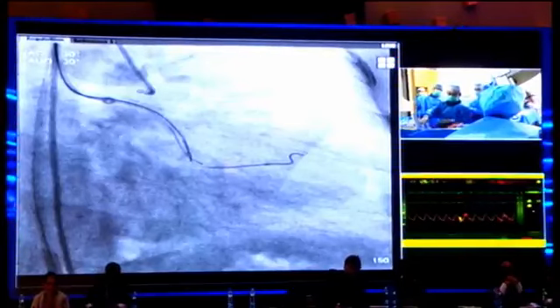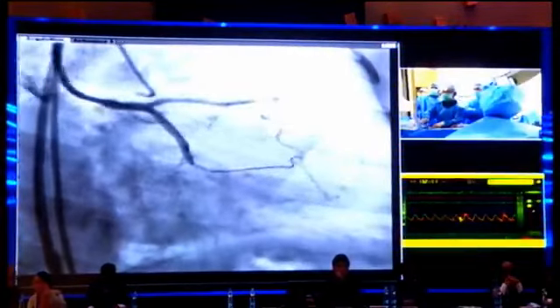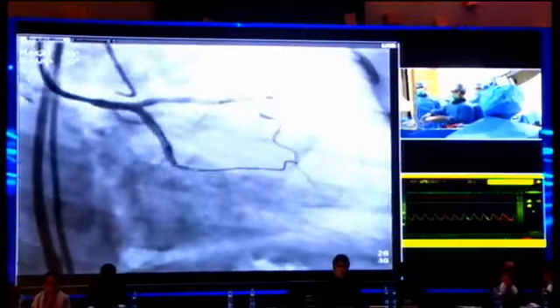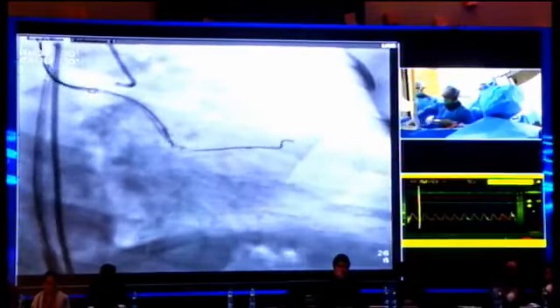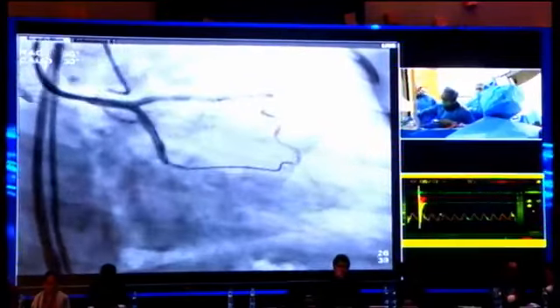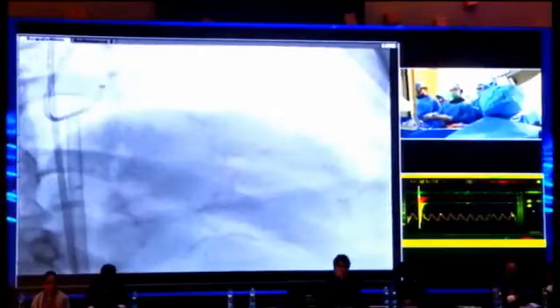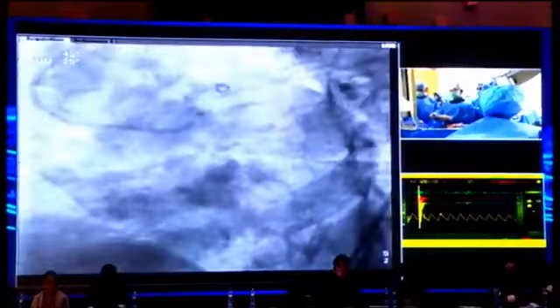So I thought I would explain about the current situation. Okay, Dr. Nagamatsu, we are on live with you. Can you tell us how far you have progressed? I think you have already fixed the proximal lesion with a stent. I think you have an anchoring balloon on the side branch. Can you tell us what you have done so far?